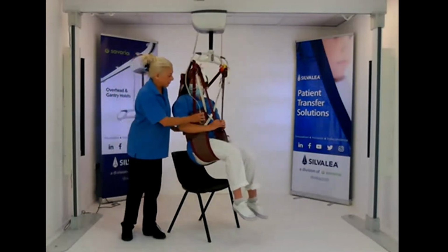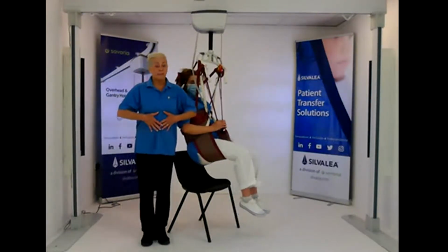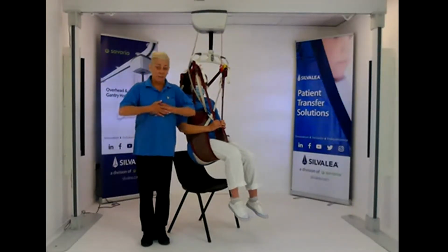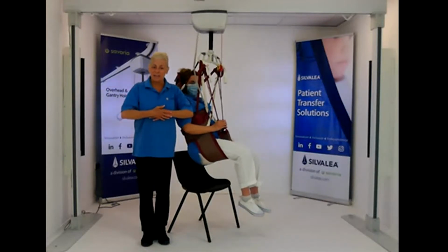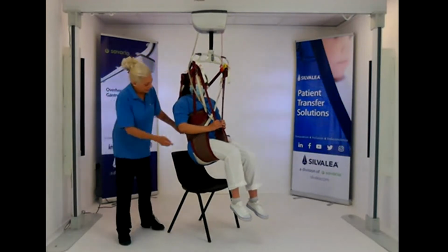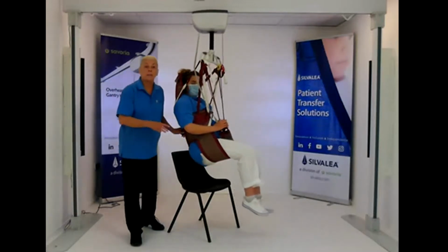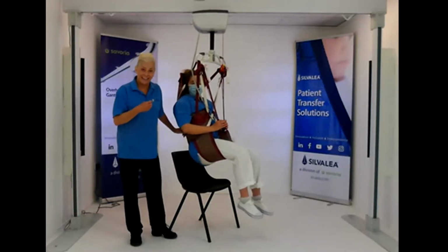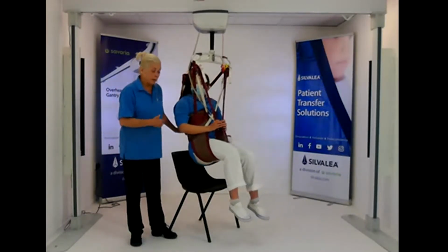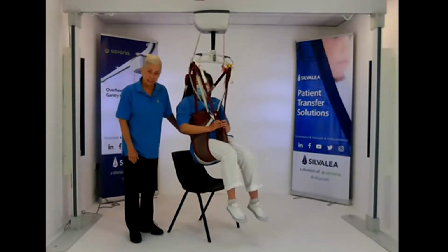It will fit firm. So the disadvantages are that it's going to fit very firm here. So anyone that's got breathing difficulties or they don't like the restriction, it may not be suitable. It's going to give a slight push up of the bust. So thinking about ladies, young ladies, it will fit firmly around the bust. And it does fit very firm around the belt line there. So anyone that's very curvy, it might bite in. So you just need to think about the body shape. But it has worked very well for athetoid CP, long and slim type situations.